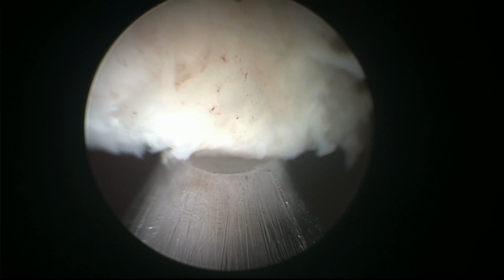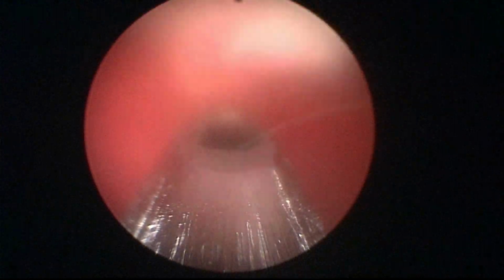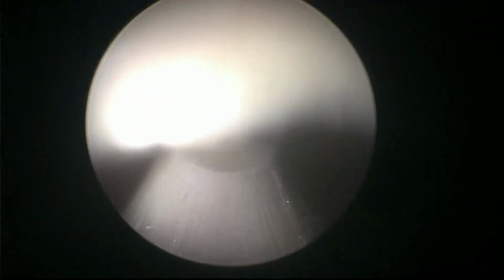This is the morcellation phase. Again, trying to simplify, I use only one inflow, which works well for me with this equipment, but of course I am very vigilant. If morcellation is not very efficient, I'm very aware that I will be sucking out a lot of water, and then I stop and refill before I continue.